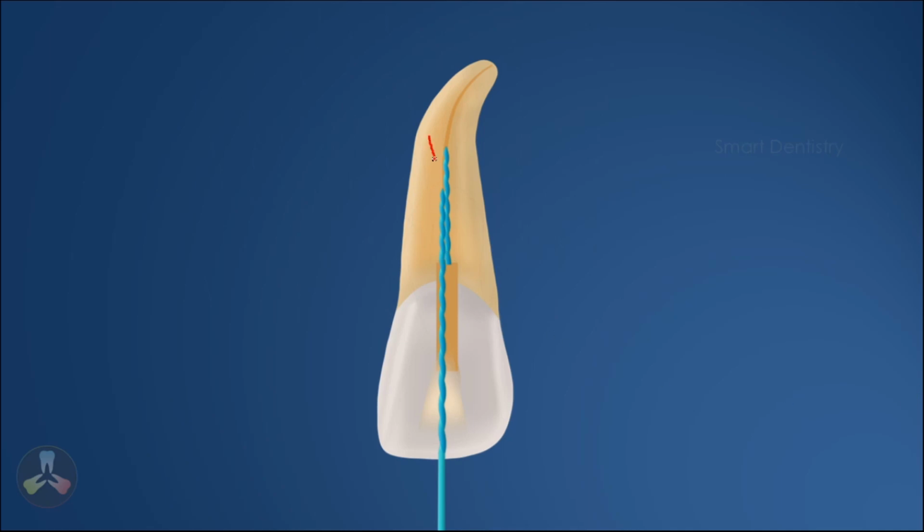between the canal and the fractured file. In most situations, we will be able to push a small file sidewise to the fractured file. But always make sure that you use a new file out of the box. Do not use a used file or an old file for negotiating or attempting to remove a file.